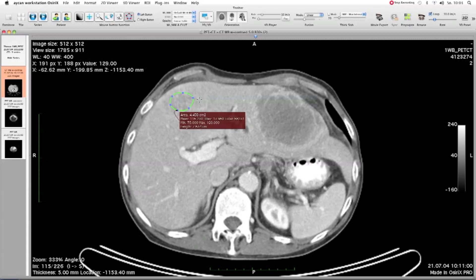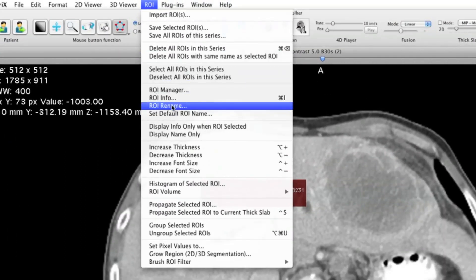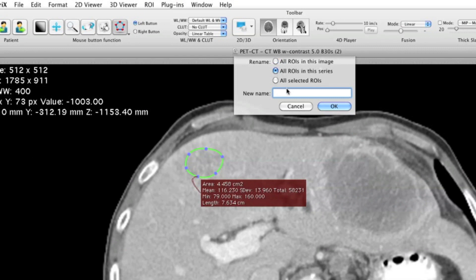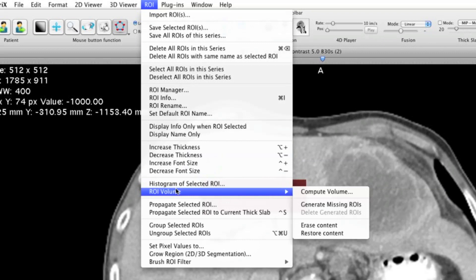Now I have maybe ten slices with the lesion and I have marked up three or four closed polygons. OsiriX can calculate the missing polygons. For that, we have to give all the polygons the same name, which is done via the menu: ROI > Rename. Select all ROIs in this series and give it a name, like "1".